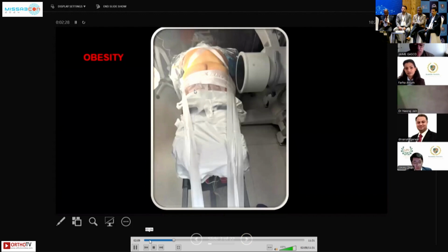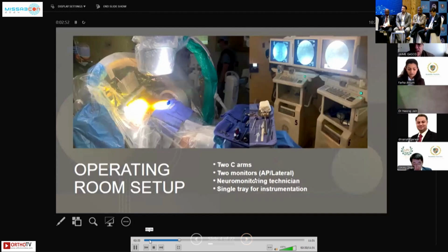As it was shown previously by one of our colleagues, the taping technique that I'm doing now for very obese patients, BMI 45 or greater, this was a BMI of 51. We tape over the top to the contralateral shoulder from the belly up, and also to do the same thing caudally and then across. So we find that this helps a lot with the X-ray technique.